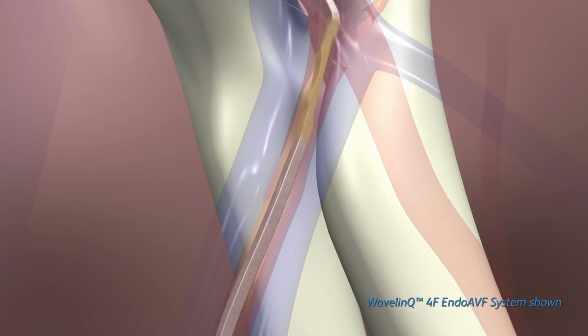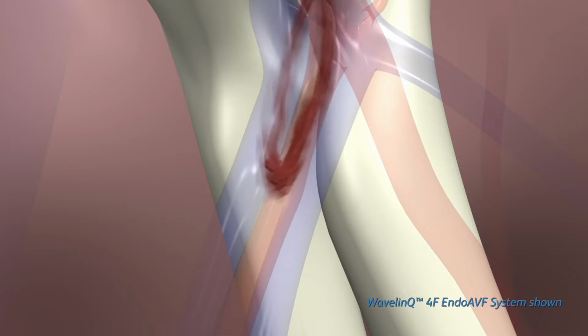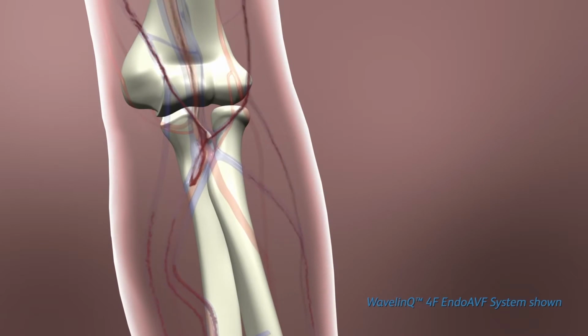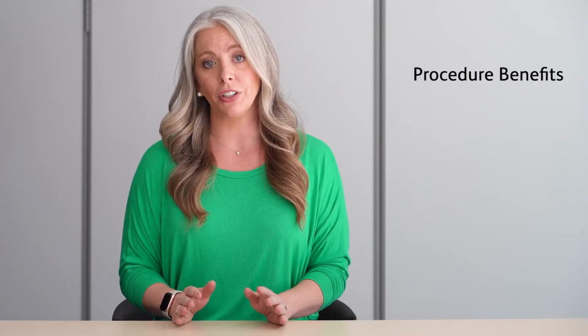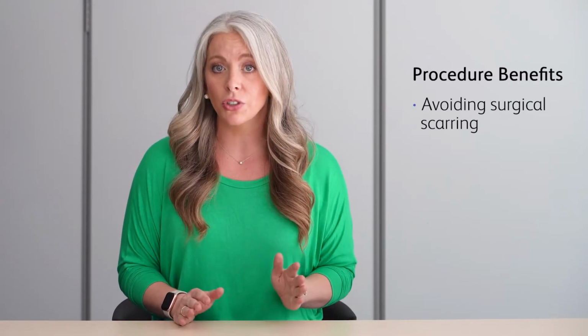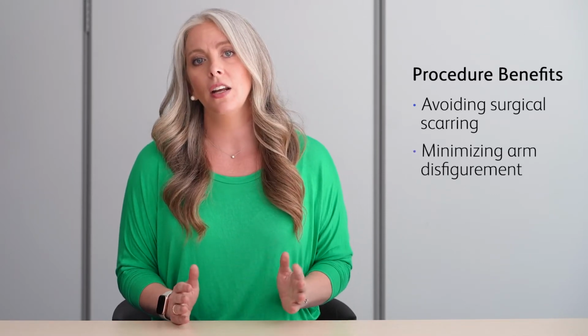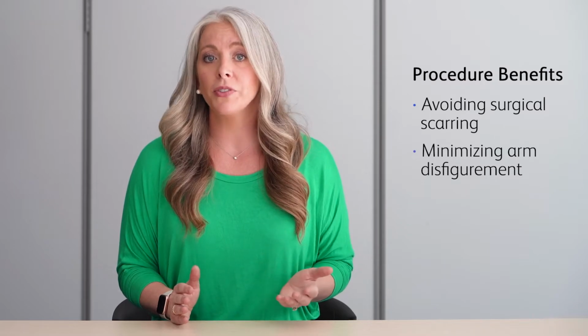A brachial vein embolization is then recommended to divert more flow through the superficial veins, cephalic, median cubital, and/or basilic veins for dialysis. Benefits of the WavelinQ EndoAVF procedure include avoiding surgical scarring and minimizing arm disfigurement generally associated with the fistula created with open surgery. Prior to the WavelinQ procedure, patients are evaluated to determine if they are a candidate for an EndoAVF through vessel mapping.